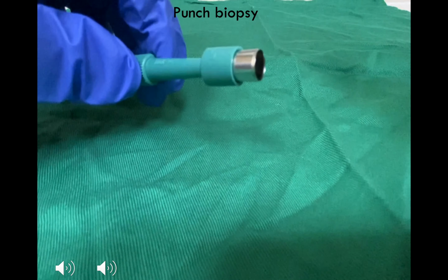The reddish spot is an ulcerated lesion, and I'm going to do a punch biopsy using this punch number 6. Please note the cutting area is a circular blade. Before cutting, we give LA first. Then the punch is placed perpendicularly to the lesion.